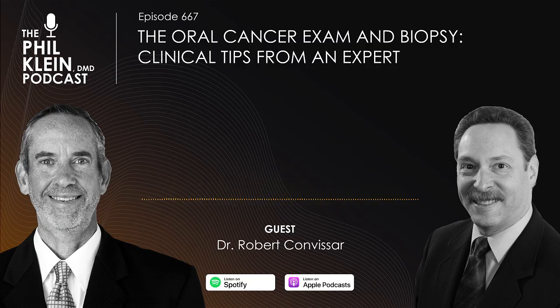It doesn't tell you it's cancer. It usually implies that that tissue is more mitotically active. And we know that cancers grow faster and cancers are more mitotically active. If you cut yourself and the cut is healing, you take a look at the cut through goggles or something similar 24 hours after you cut yourself, it will look a little different than the surrounding tissue because as that area heals, it's more mitotically active. So that's basically how it works.